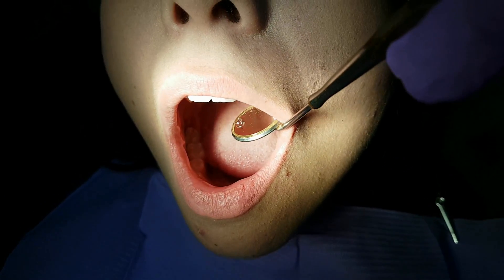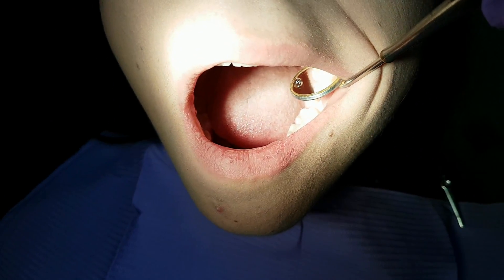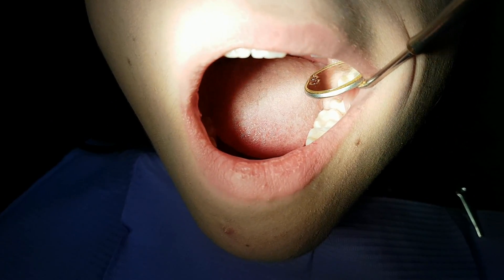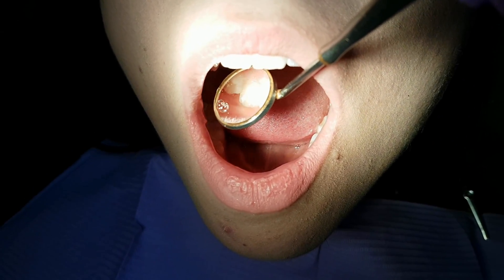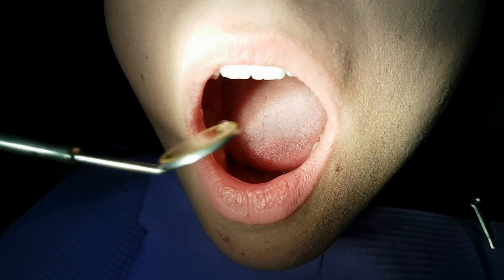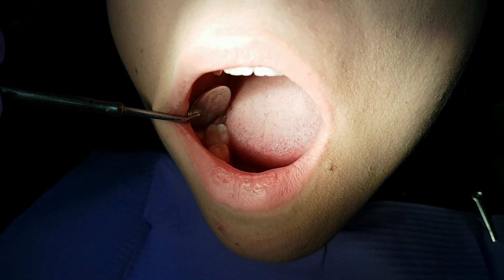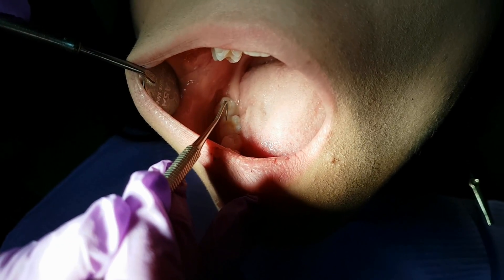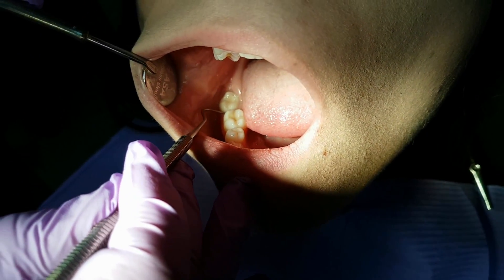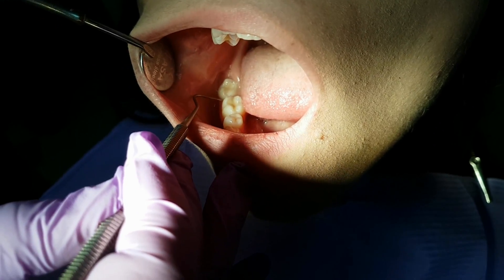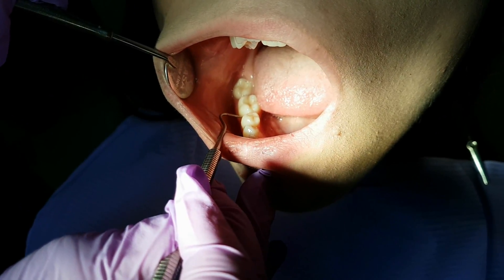This is how the dentist uses indirect view. And using the dentist explorer we can see if the patient has cavities or problems with the periodontal ligament.